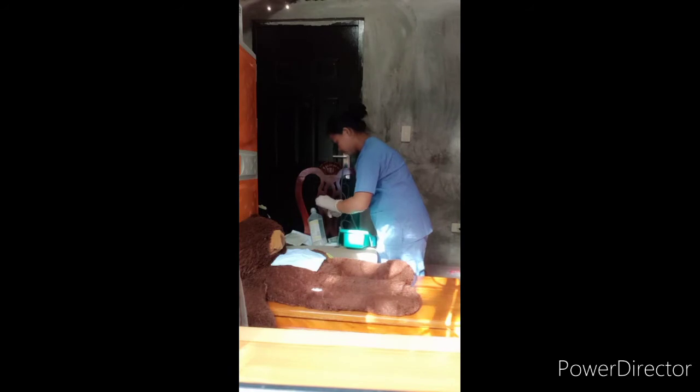Okay. And then next, let's open the pack of water-soluble lubricant if necessary and apply to the catheter. And then next, let's apply sterile gloves properly. And then next, let's pick up the suction catheter with the dominant hand and pick up the connecting tubing with the non-dominant hand. So, secure the catheter to the tubing.